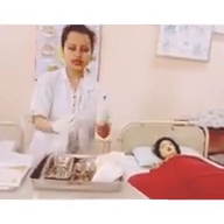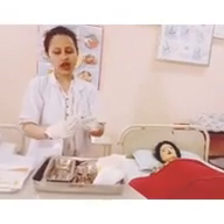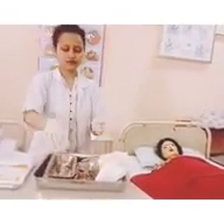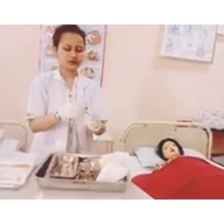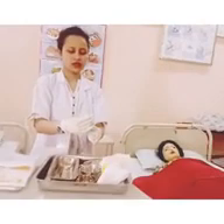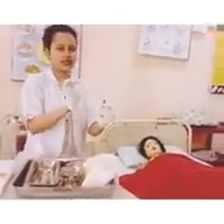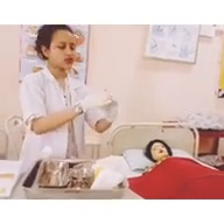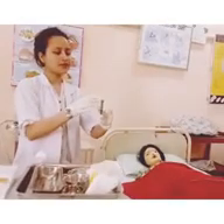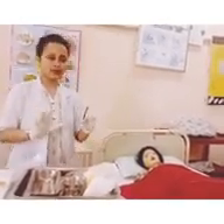I have already filled up the medication — I am drawing it with the syringe. After I have drawn the medicine, I check for any air bubbles. If there are no air bubbles and just a drop of medicine is at the tip, then I would be ready for providing the injection to the patient.